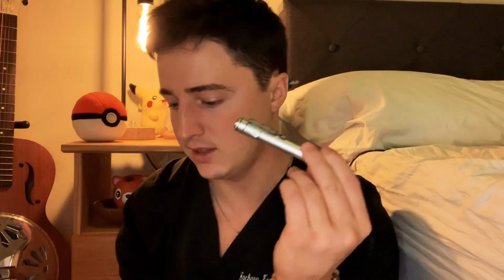It also has 3 brightness settings. And this one is a lot more tolerable on the lowest setting, so I typically use it on the lowest setting, and that's not too bright for patients. So you've got the lowest, the very bright setting, and then this kind of medium setting, but I like the low setting. It tends to work fine. So this is actually the pen light that I use.